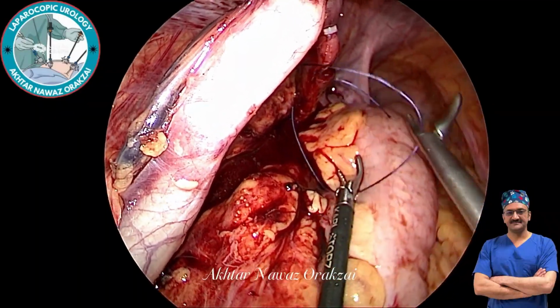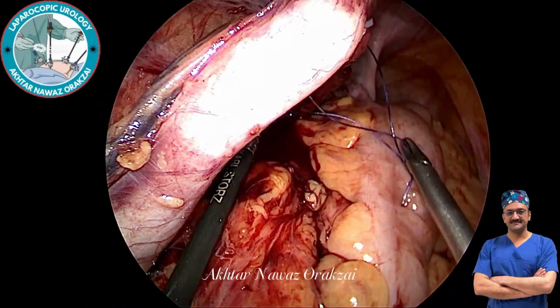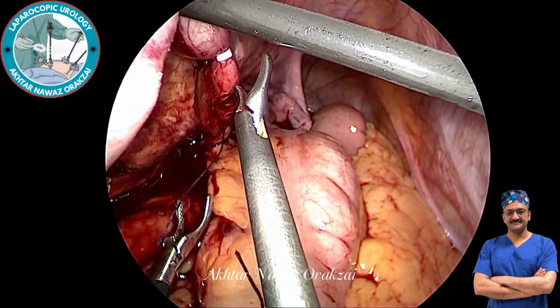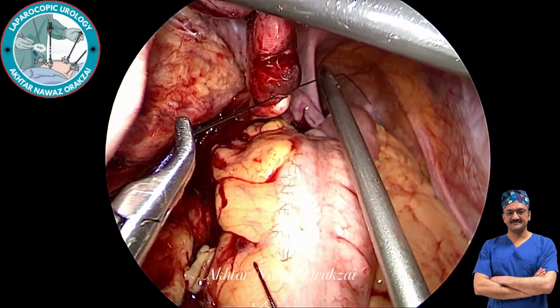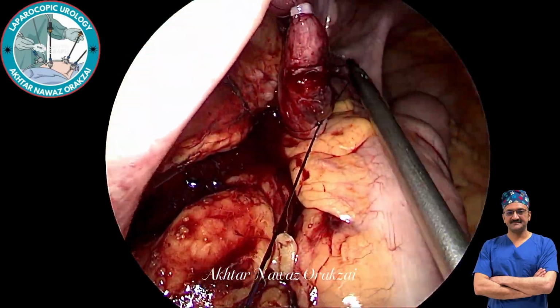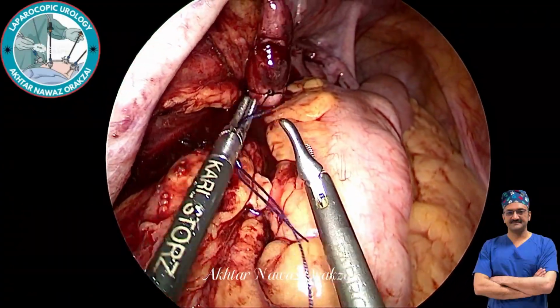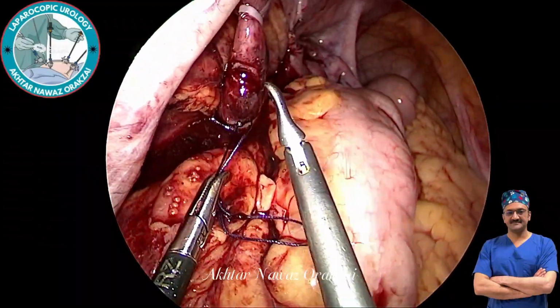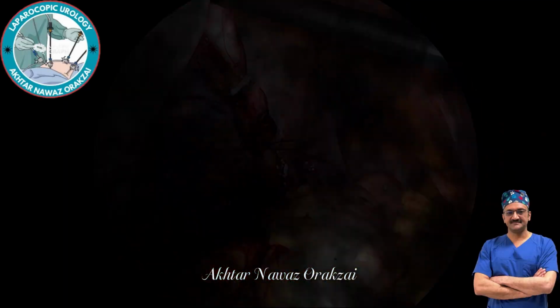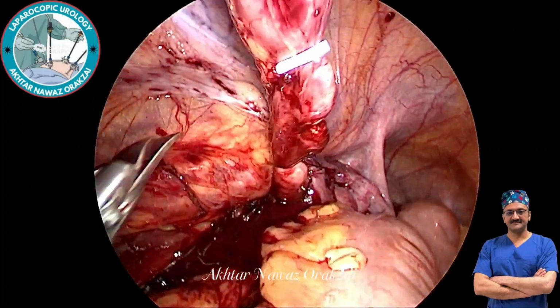The purpose of removing or suctioning the urine from the distal part of the ureter is that this part of the ureter may at times lead to infection, because the urine is static between the ligature and the stricture, and this can lead to abscess formation, sepsis and everything. So that's why I emptied the ureter distally, and then we cut the ligature, and then we divide the ureter and remove the specimen. Thank you very much for watching.